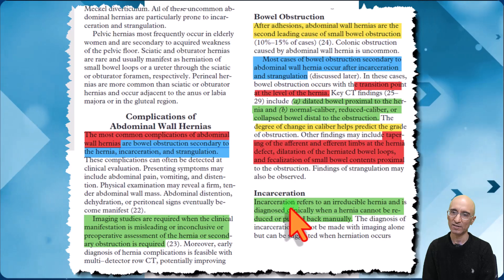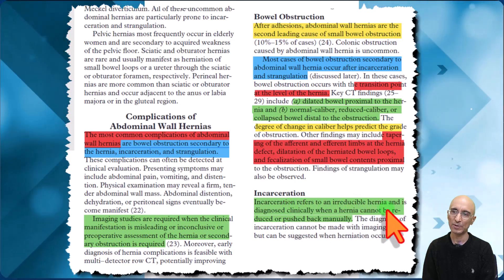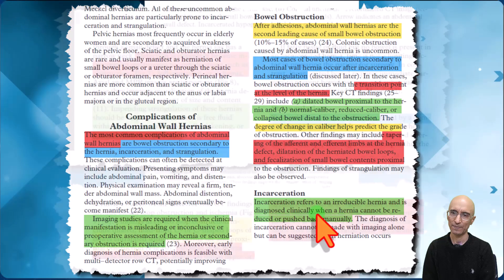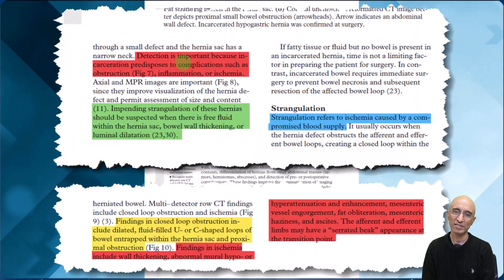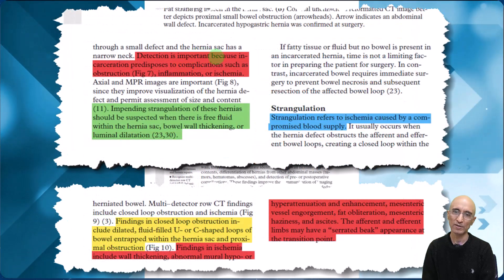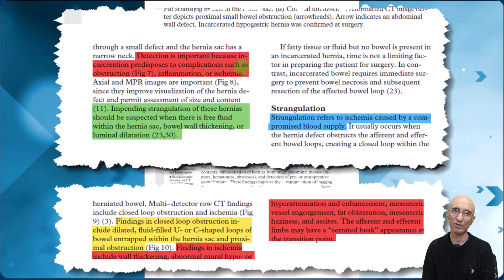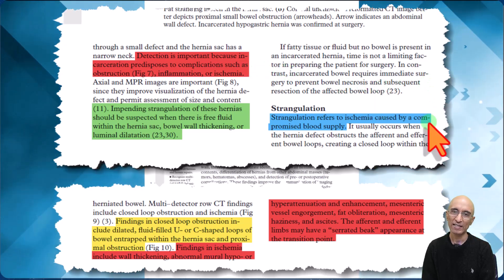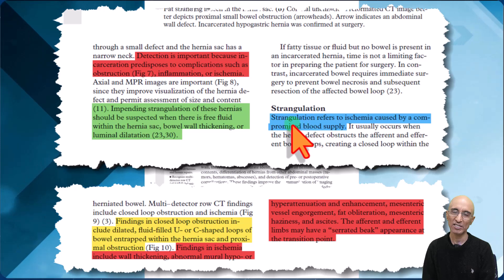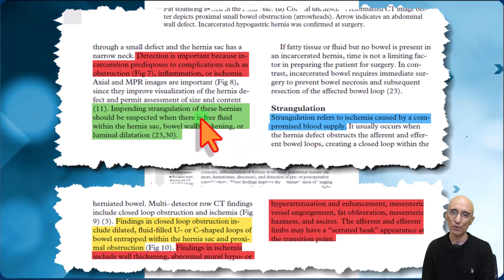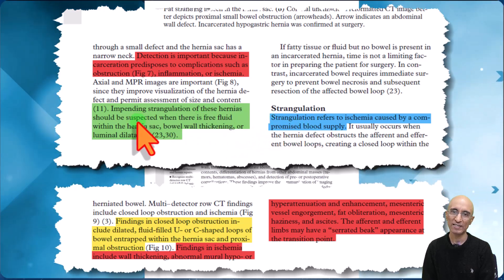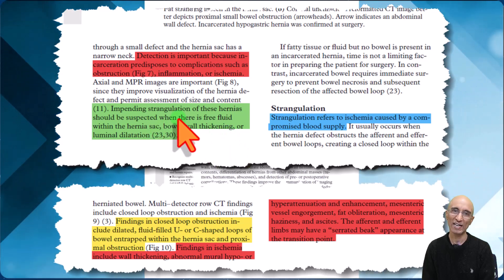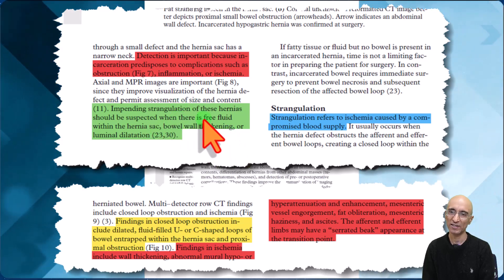With regards to incarceration, it refers to an irreducible hernia which is usually diagnosed clinically. Diagnosis of incarceration is important because this can lead to ischemia if not treated in a timely fashion. Signs of impending strangulation on CT would include fluid within the hernia sac, as we saw in our patient, bowel wall thickening, or luminal dilatation within the hernia sac.